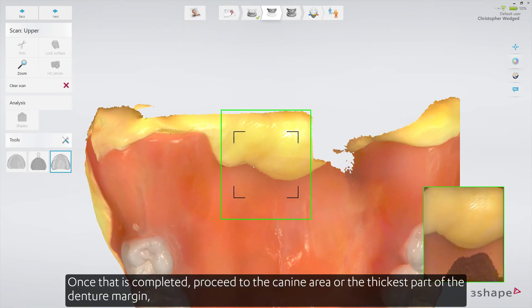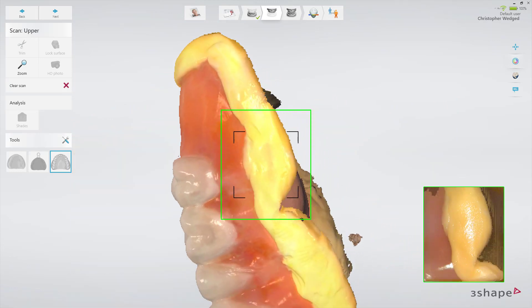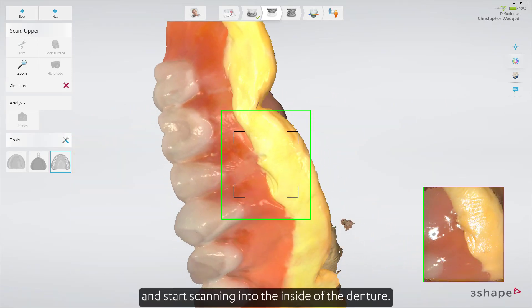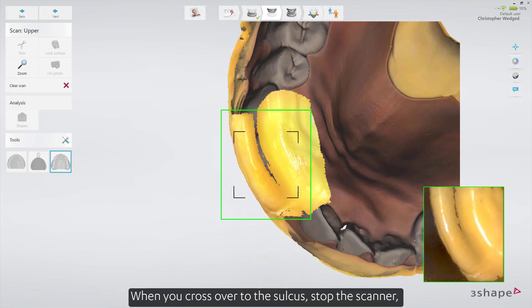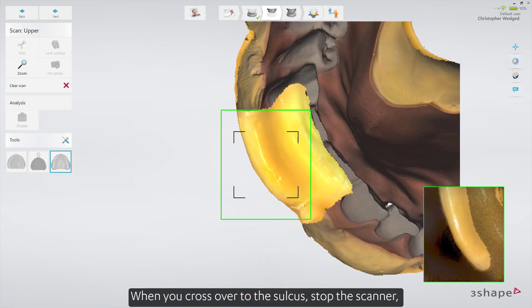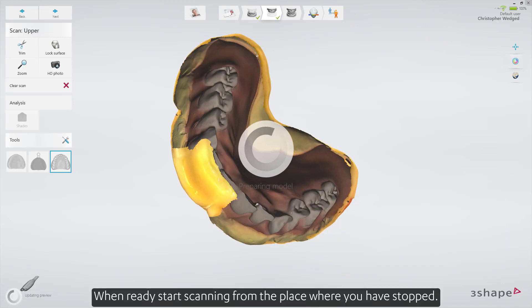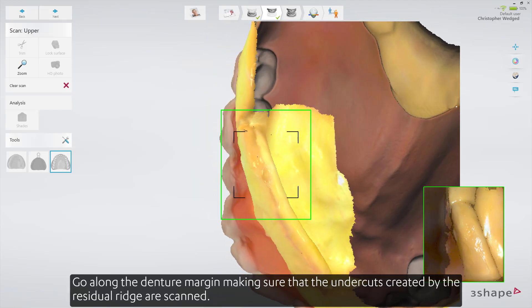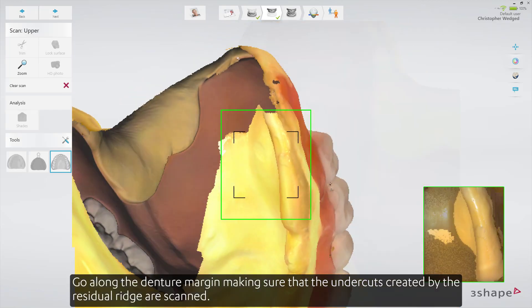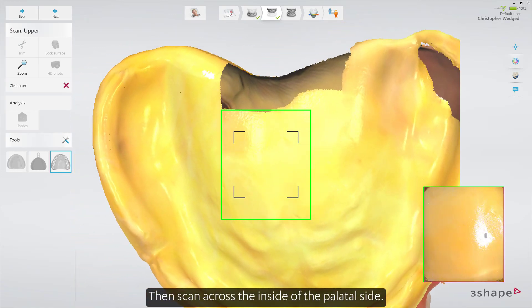Once that is completed, proceed to the canine area or the thickest part of the denture margin and start scanning into the inside of the denture. When you cross over to the sulcus, stop the scanner and allow the software to optimize the scan. When ready, start scanning from the place where you stopped. Go along the denture margin, making sure that the undercuts created by the residual ridge are scanned. Then scan across the inside of the palatal side.